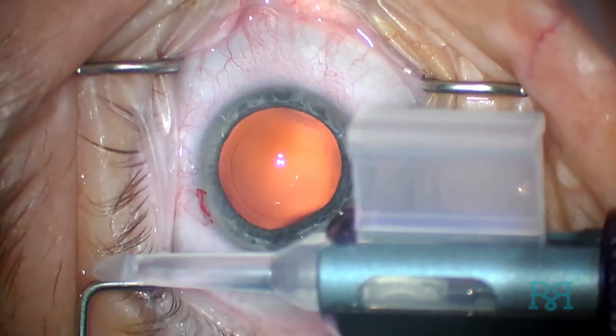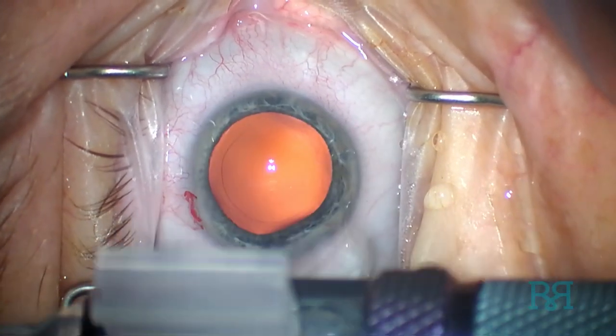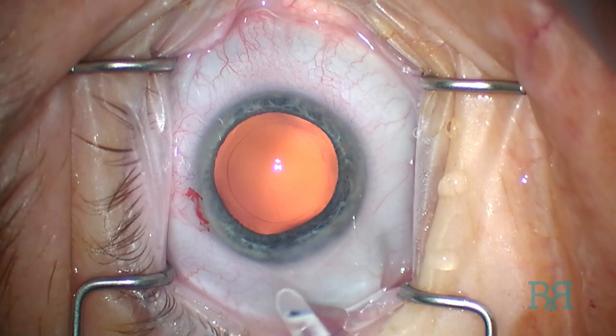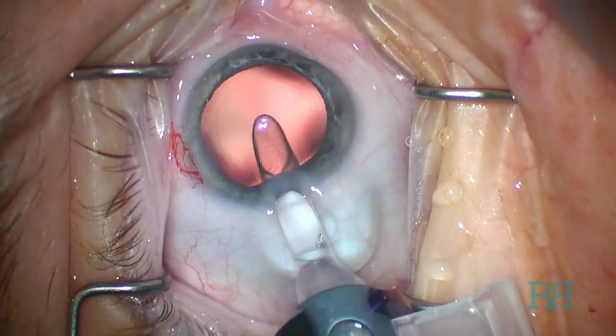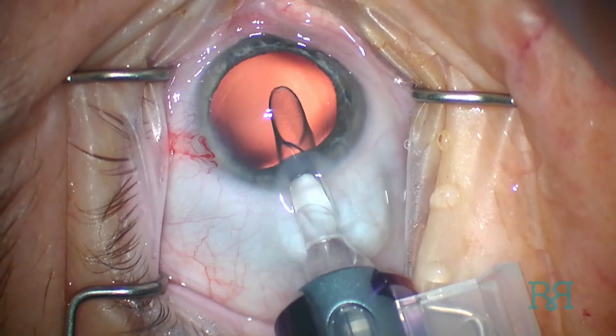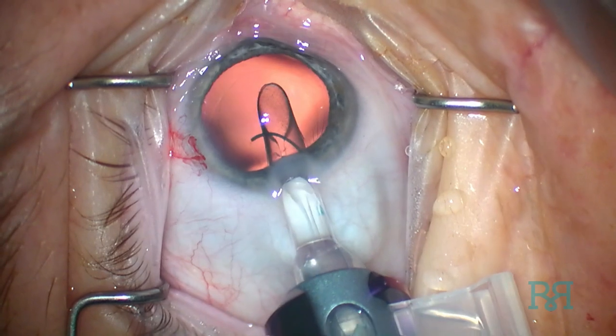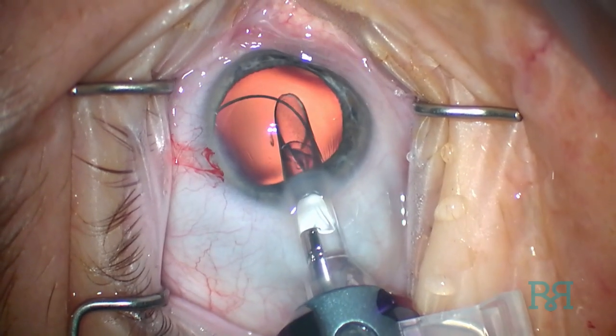The LAL is inspected and verified to be loaded appropriately. It is then placed through the temporal incision with or without the assistance of a second instrument, such as a .12 forceps. We will watch the insertion in real time and then go over the details of the insertion in slow motion.